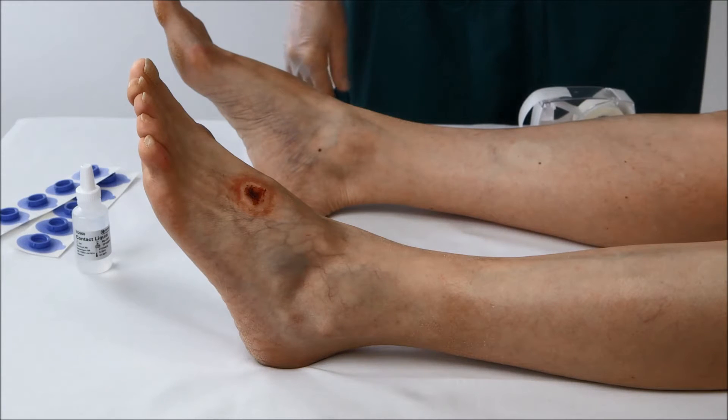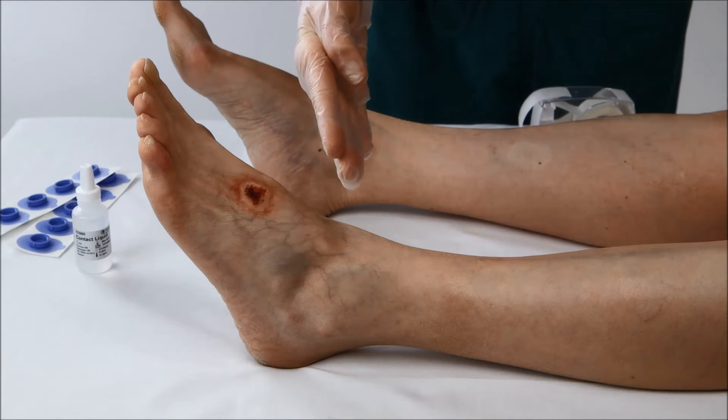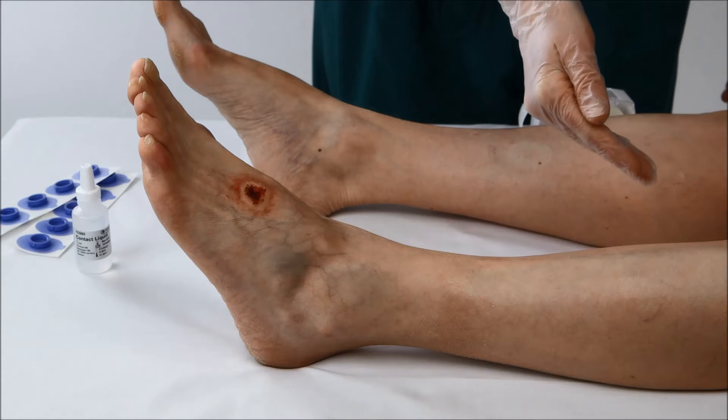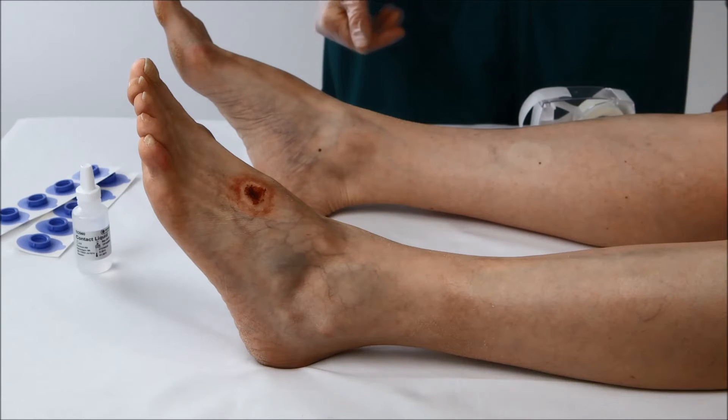Now place the electrodes on the patient. It's useful to place several electrodes around the wound. To map the extremity, place electrodes below the knee down to the foot. As a reference, you might consider placing an electrode on the opposite foot.